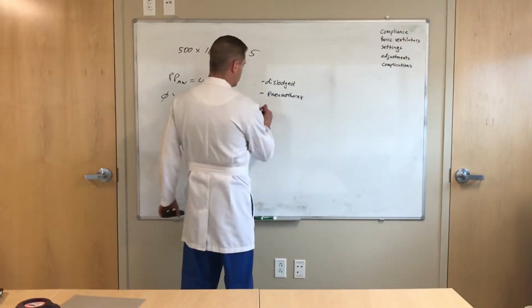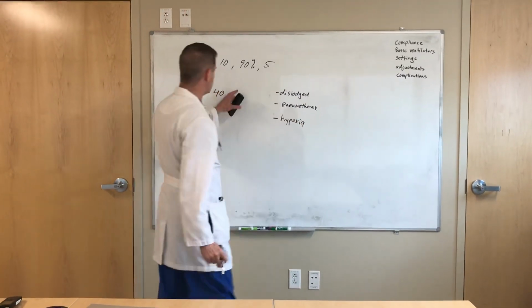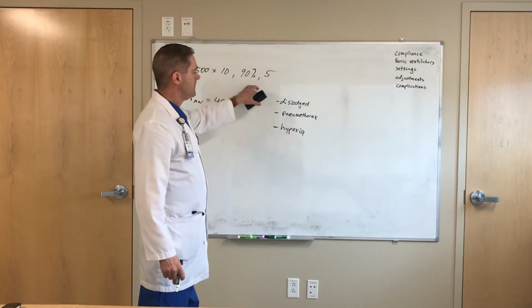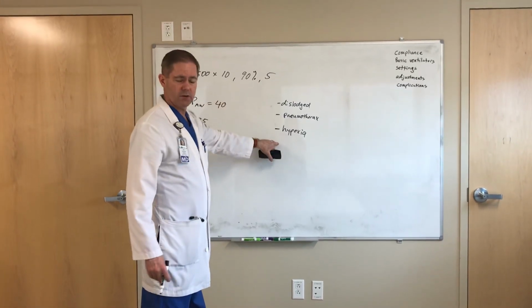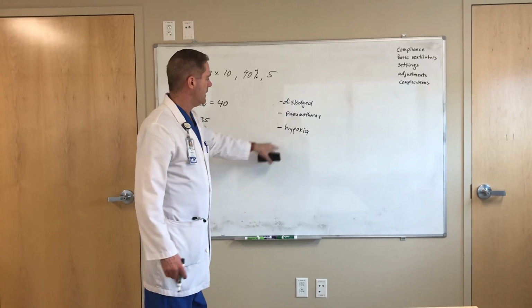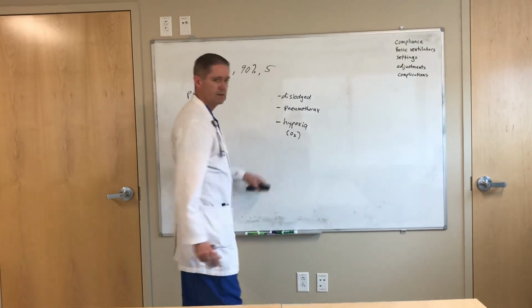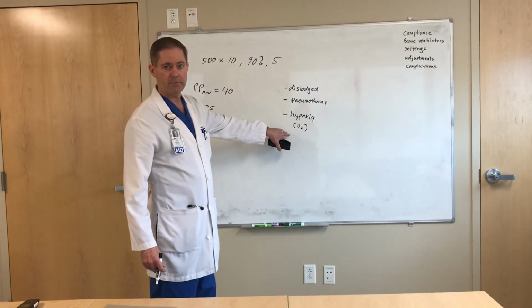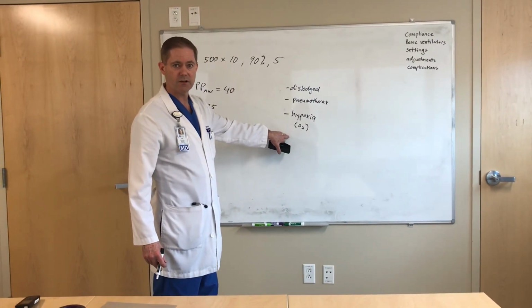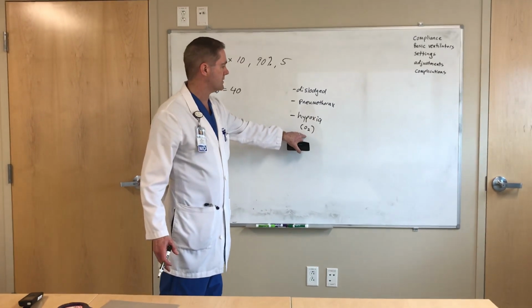All right, hypoxia, right? You can't oxygenate, so you're going to have to make adjustments. You're going to have to go up on your PEEP. You may have to treat your bronchospasm aggressively. All right, make sure you have oxygen. I can't tell you how many times I've seen the tank run out of oxygen, and if the patient's desaturating, everybody's going crazy trying to figure it out. What happened was there's no oxygen in the tank. All right, so make sure you check that.